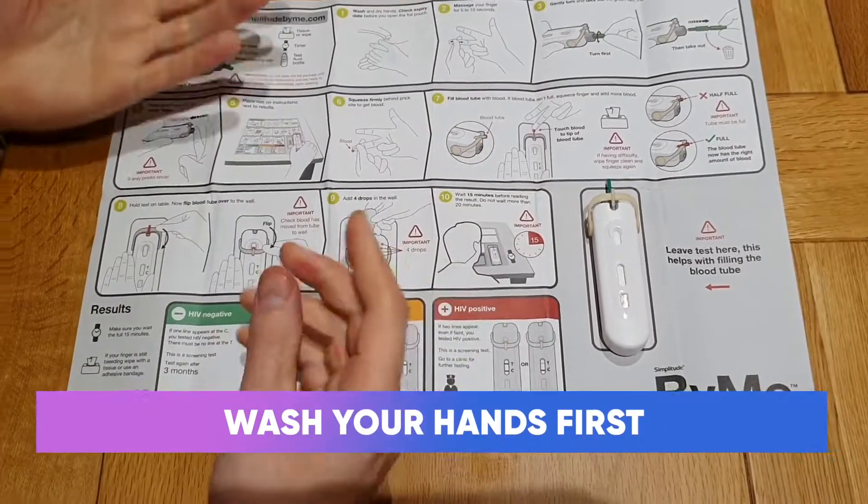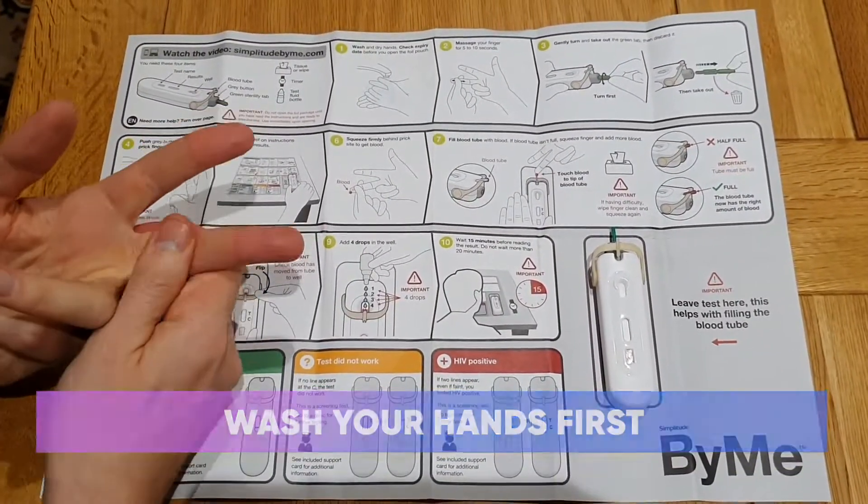I have actually already washed my hands, and I'm just going to do this for five or ten seconds.